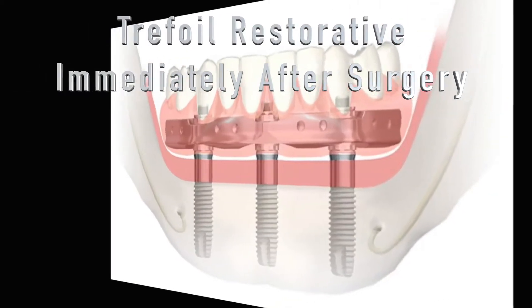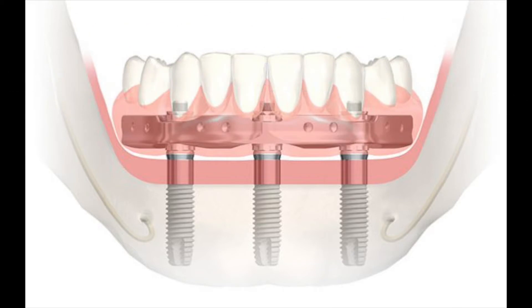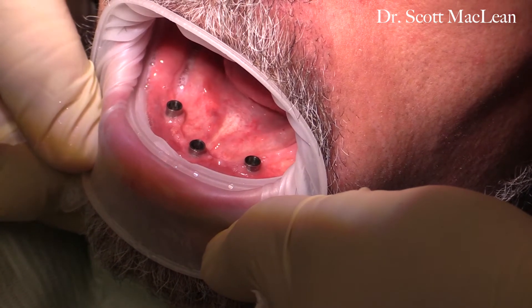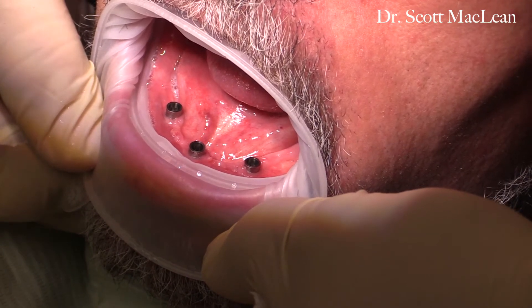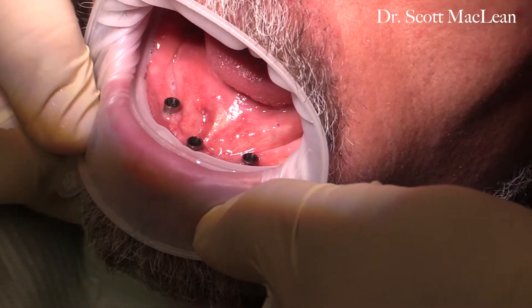During this presentation we'll be discussing the Trefoil restorative. Once the surgery has been completed, the restorative team would start to do the adaptation of the bar to the implants to make it passive, then following this to do occlusal records. We're going to show a patient who's already healed, but typically the patient would be at the point where the implants were placed and sutures would be in place as well. We don't want to have a lot of bacteria or spend a lot of time with the patient having their mouth open.